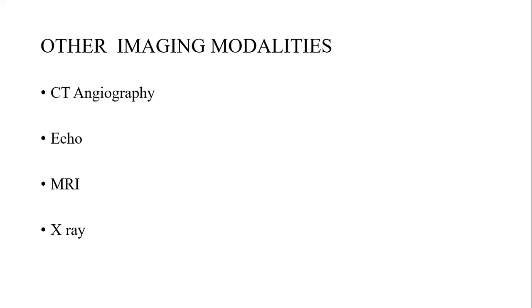Then the other thing, it will also identify the arterial branches which are involved in that case. Then it can even differentiate the true and the false lumen. It can also detect extravasation, or I would say hematoma, or even pericardial effusion.